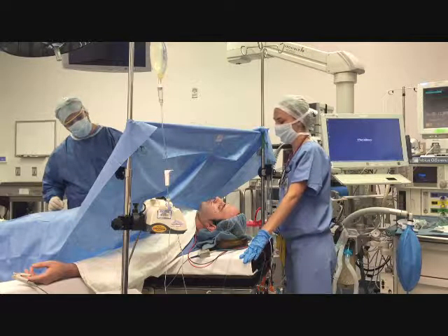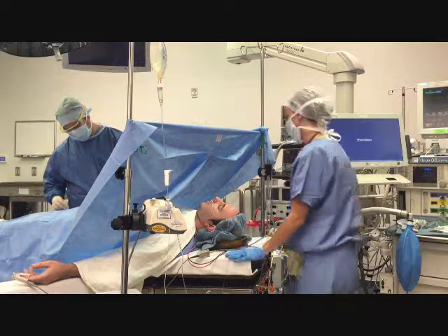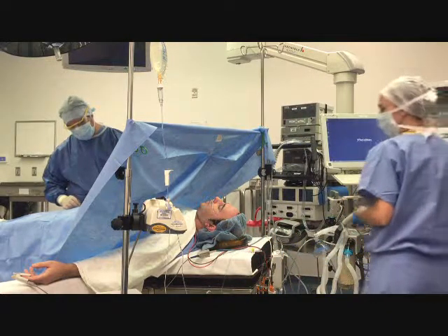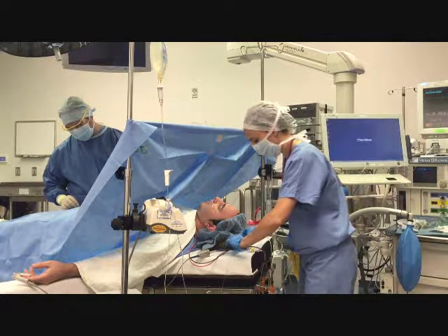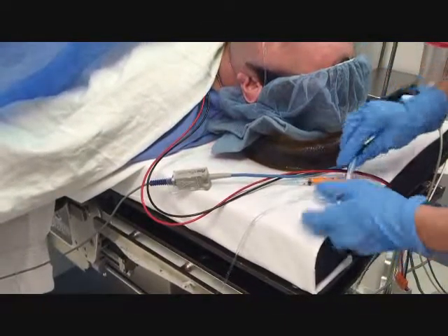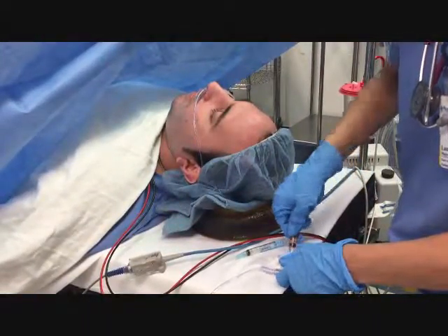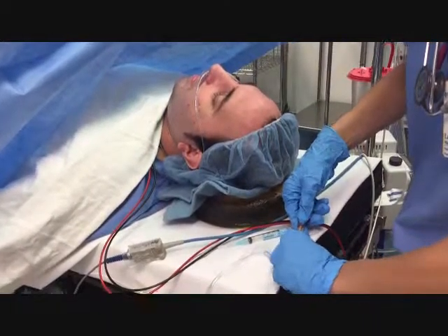The surgeon is reaching the most stimulating part of the procedure. In anticipation, additional medications are administered. Mr. Jones has now received 150 mics of fentanyl, 3 milligrams of Versed, and the propofol infusion is now running at 150 mics per kg per minute.